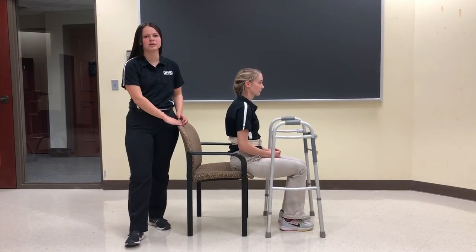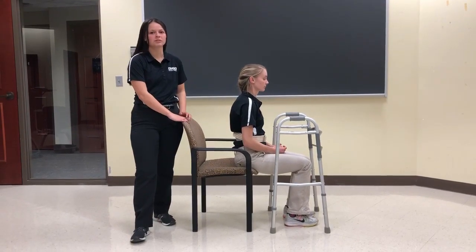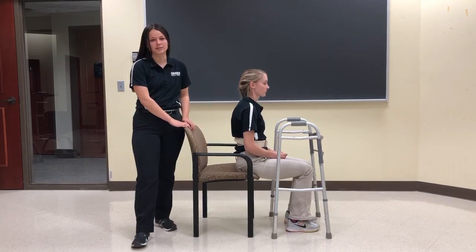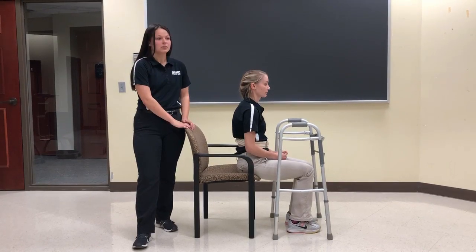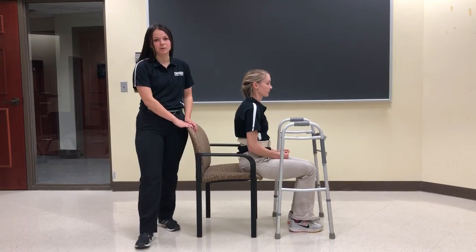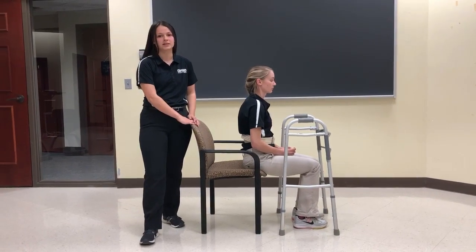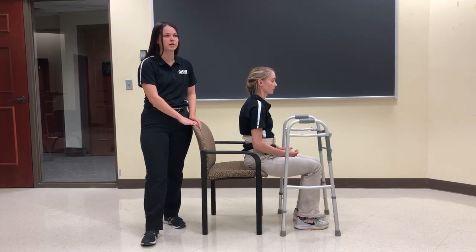Once you are positioned properly with one hand on their gait belt, you will then instruct the patient to push straight down through the armrest of the chair and lean forward simultaneously as you support them holding the gait belt. You will then instruct the patient to swing their hips forward and begin extending their legs until they are standing. Once they are steady and standing, you will instruct the patient to reach for the walker with one hand at a time.